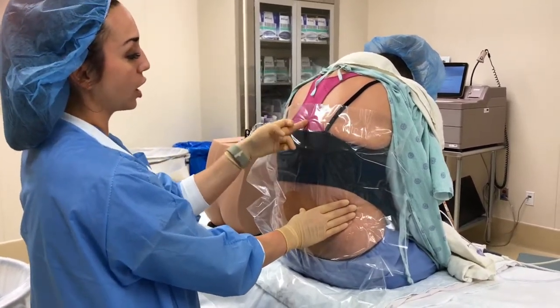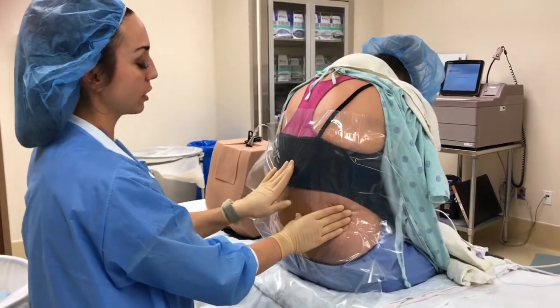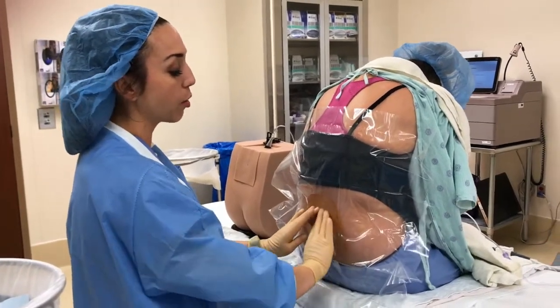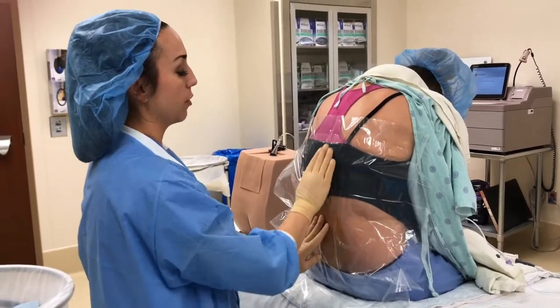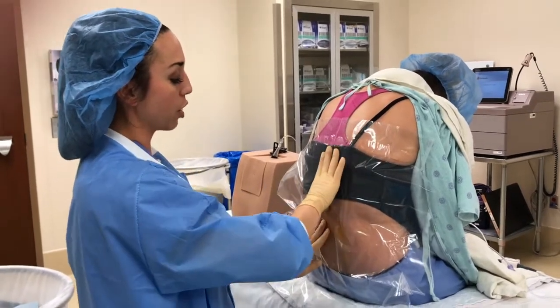And then starting at the top of our sterile drape, a lot of times I'll try to palpate some of these thoracic spinous processes, especially if the lumbars may not be as easy to palpate as some of these more superior vertebral bodies. So whatever it takes, if you can palpate up or down.